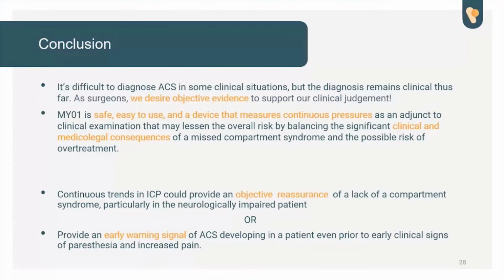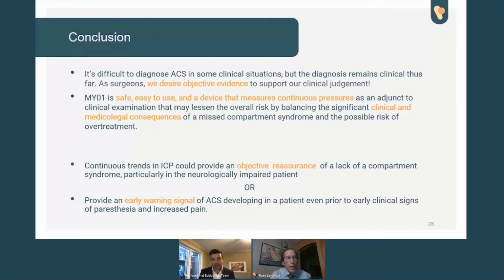We have another interesting question related to the use of the device. Where do you see the device most used within the hospital as a whole? Yeah, there's two places I believe it's going to be used. Number one, in the emergency department.